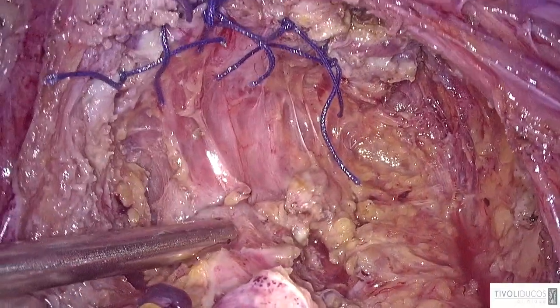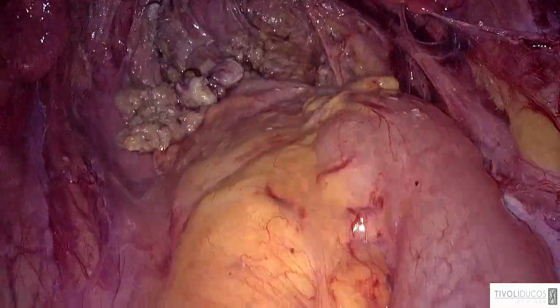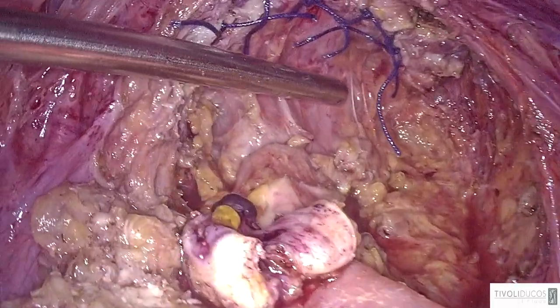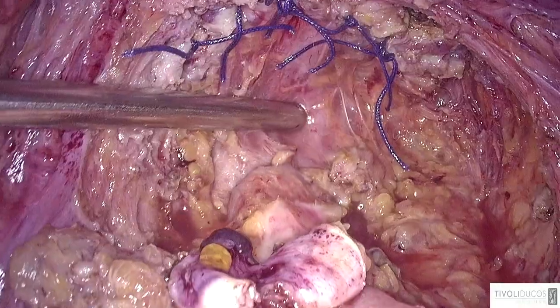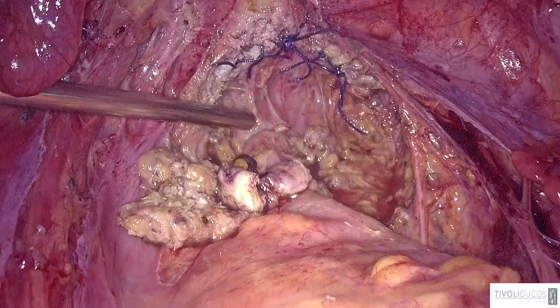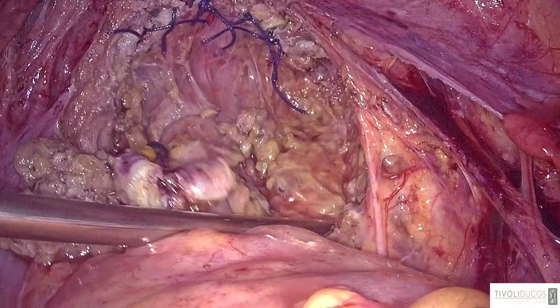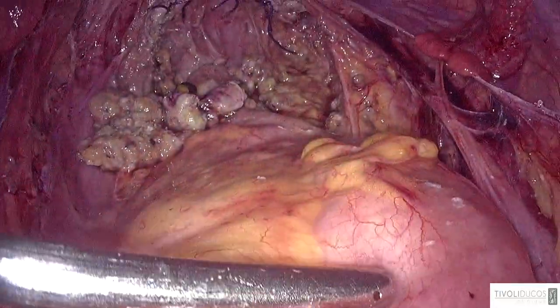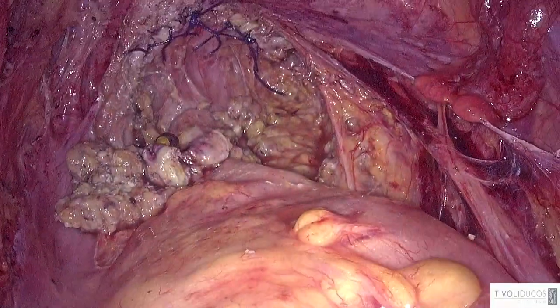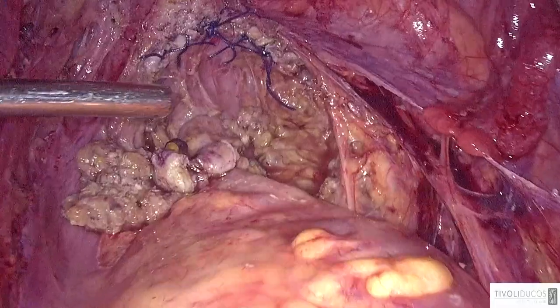If the rectal nodule is associated with a sigmoid colon nodule, we try to avoid carrying out a long low colorectal resection from here to there, and we try to carry out a disc excision here and a short segmental resection here. This is what we call combined disc excision and segmental resection of the sigmoid, and we try to preserve 7 to 10 centimeters of healthy rectum between the two nodules. So we manage.